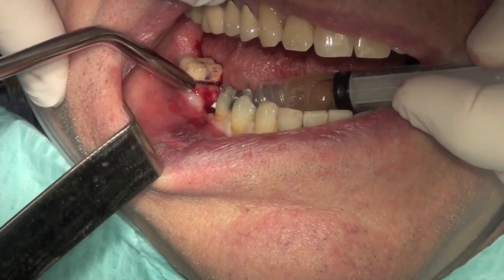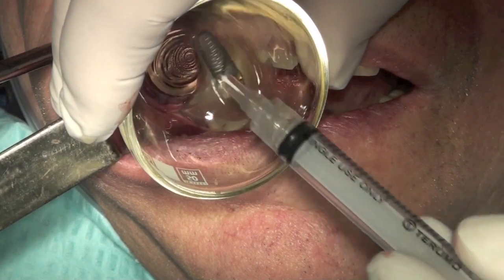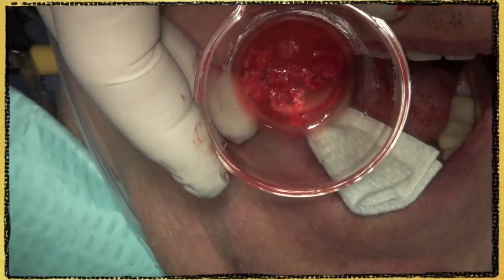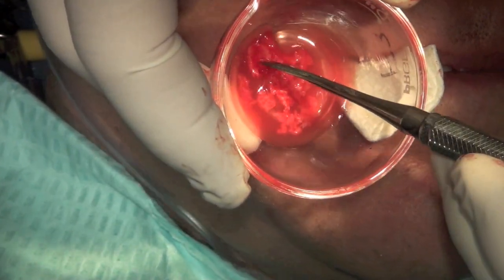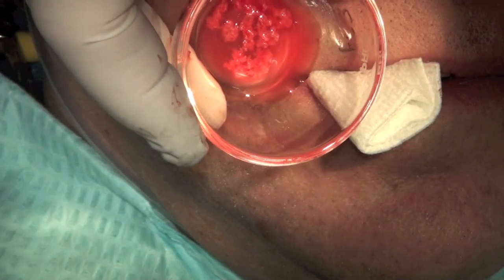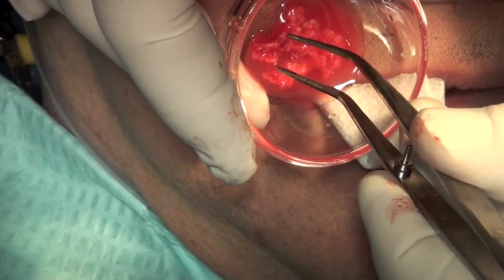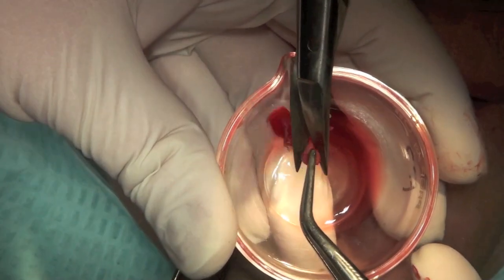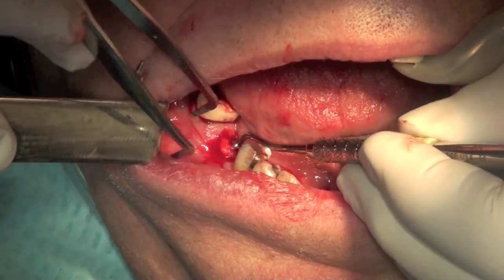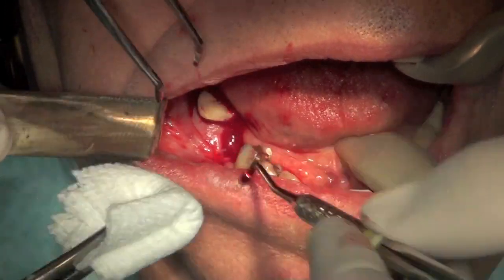If it's under a 1. You want to get the implant too? Yep. Pickups. Hold this, Tim. Give me some scissors. See on that? Yeah. Give me single ones — that's a little bit too bulky. Now let me see the implant.